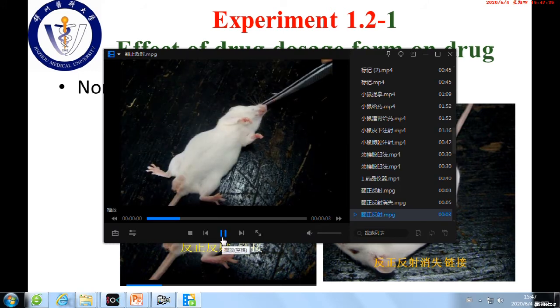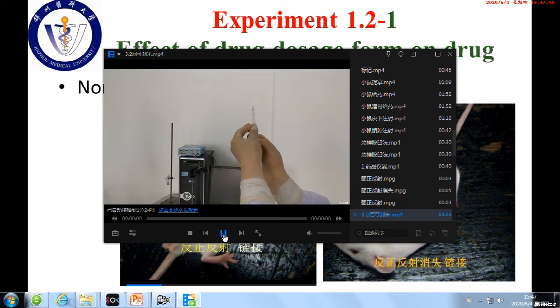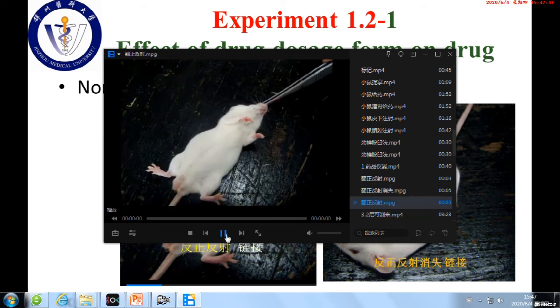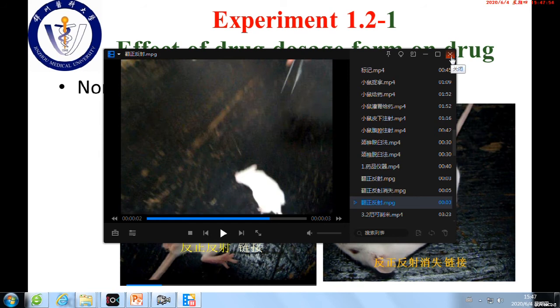Wow, very fast. See it again. Watch it again. Oh, sorry. It's so fast.